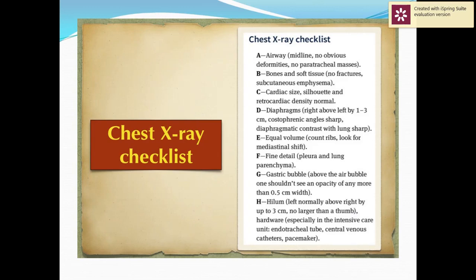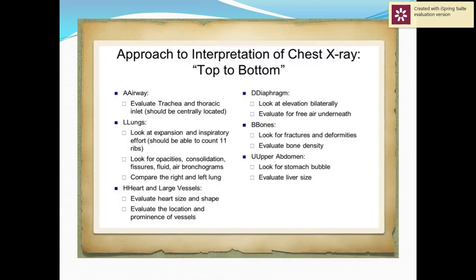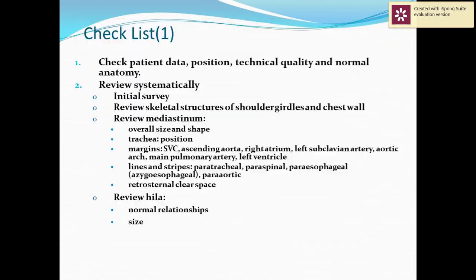Chest X-ray checklist ABC وبالتالي very important أي طبيب لازم يكون عنده mapping in his brain how to read or how to approach and to read the chest X-ray properly.